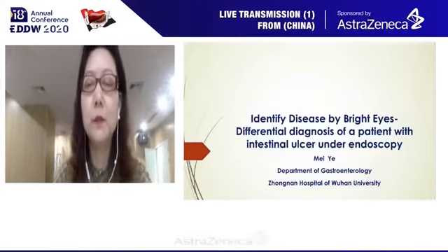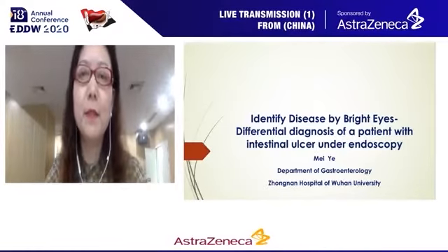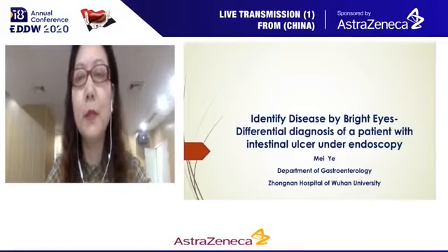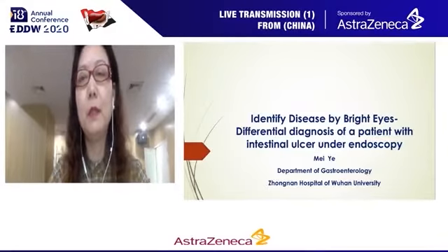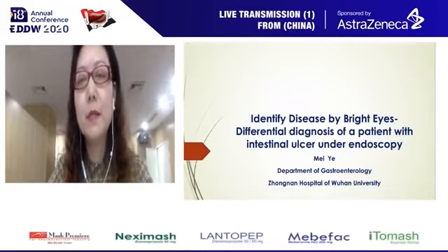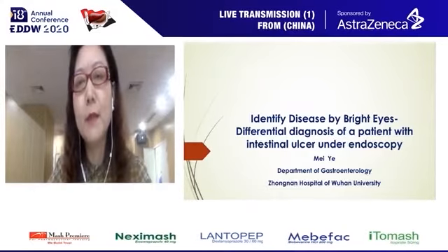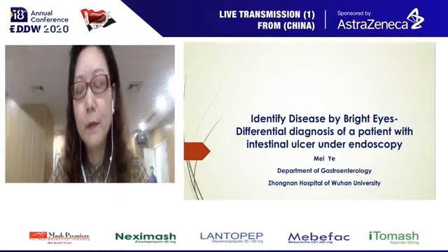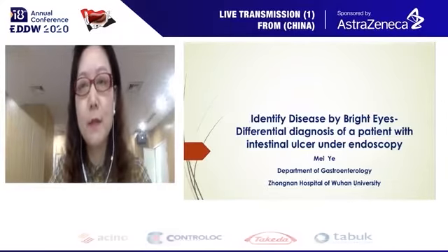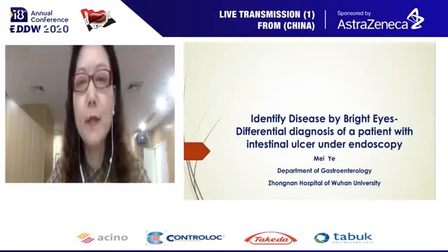Hello, good afternoon, ladies and gentlemen. It's my pleasure to be present at Egypt EDDW. Here I will share a case to show how to use endoscopy to make the diagnosis and differentiation of intestinal ulcers. The topic of my presentation is identifying disease by bright eyes and endoscopy.